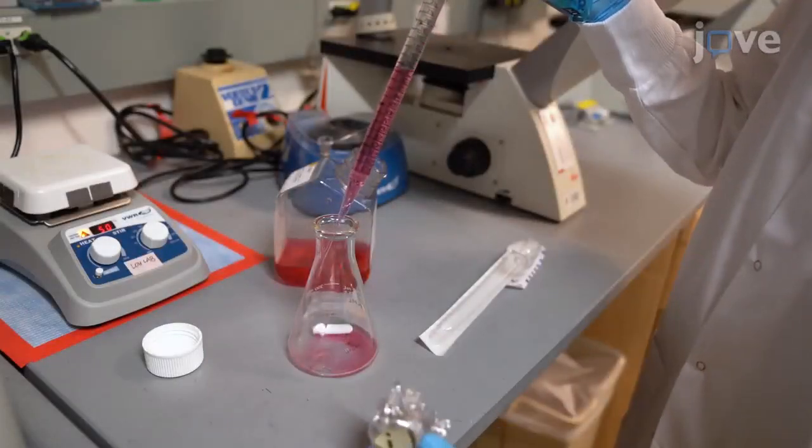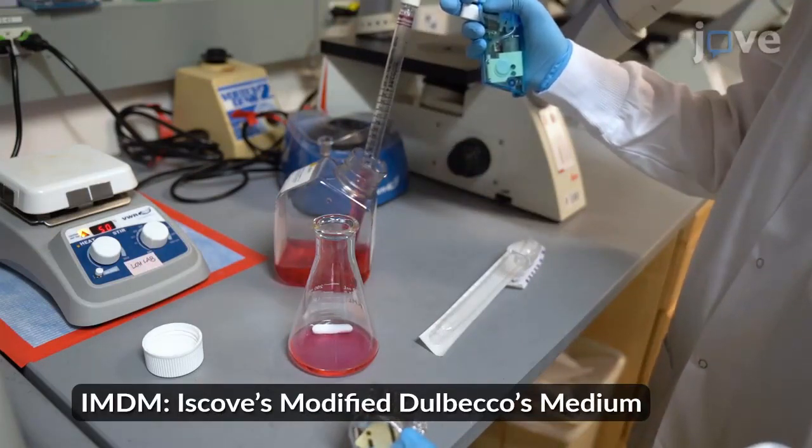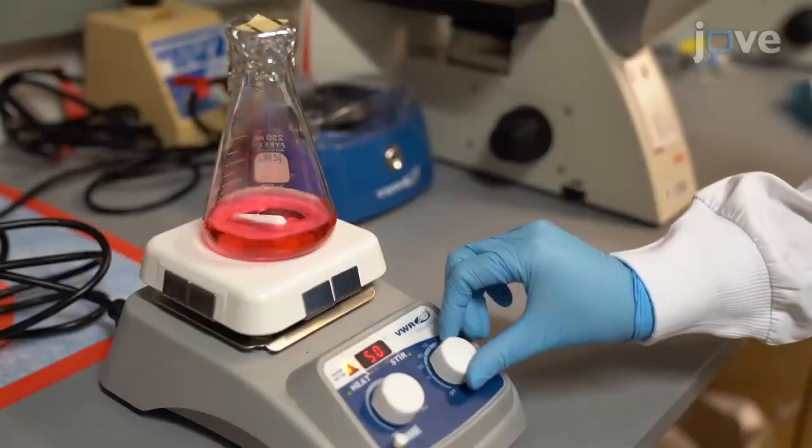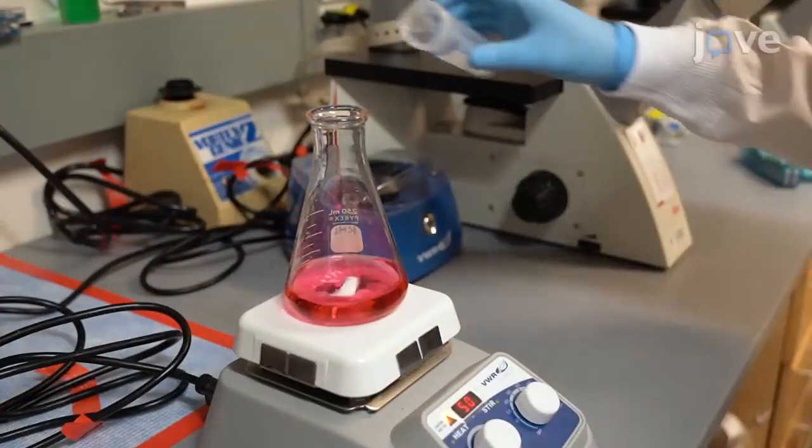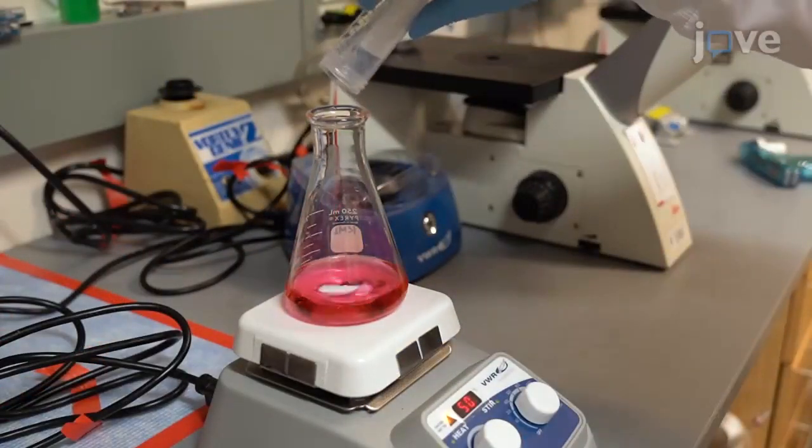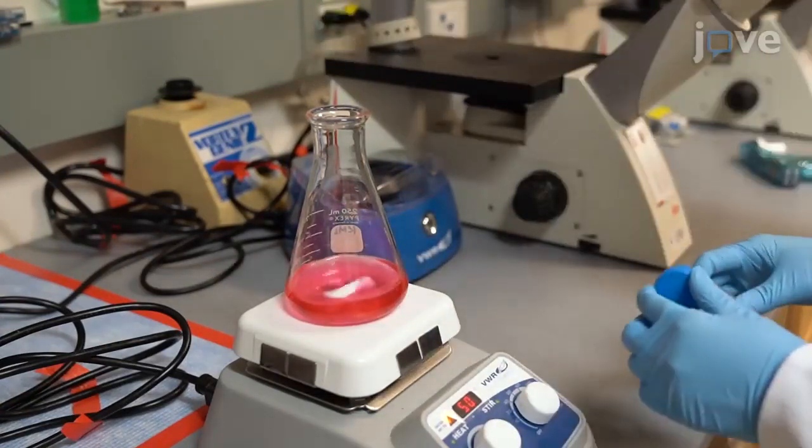To begin this procedure, add 50 mL of IMDM to a conical flask containing a stir bar. Heat the medium to 50 degrees Celsius and add 0.5 grams of PVA while continuously stirring to prepare a PVA stock at a concentration of 10 mg per mL.